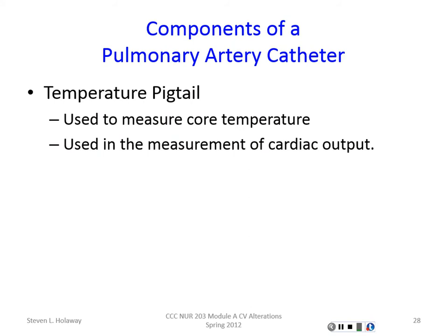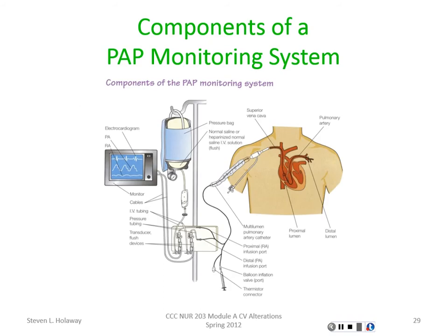The temperature of pigtail we talked about is this one. Again, that just measures core temperature. It's also necessary as we do the cardiac output on these patients. There are some new ones that actually do continuous cardiac output monitoring. I haven't had the opportunity to work with one of those, and I would love to work with one of those and see how it works.